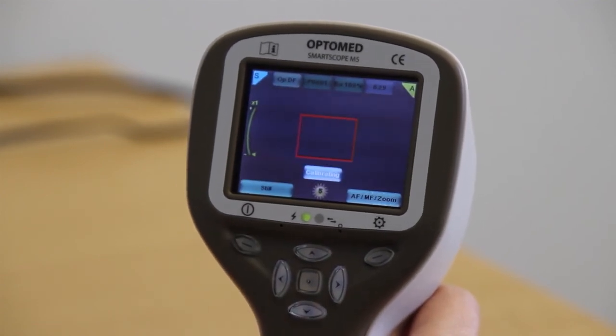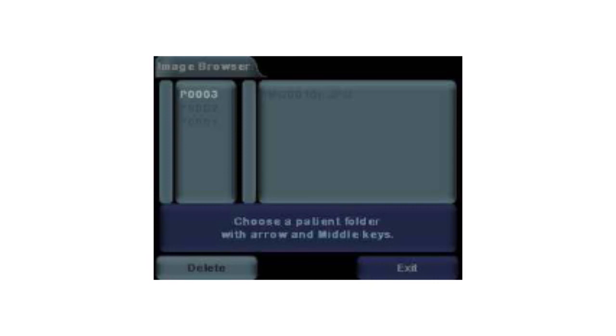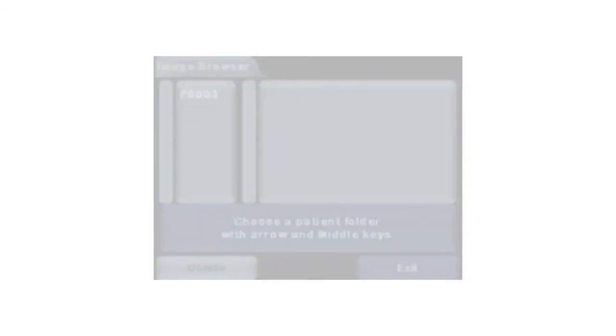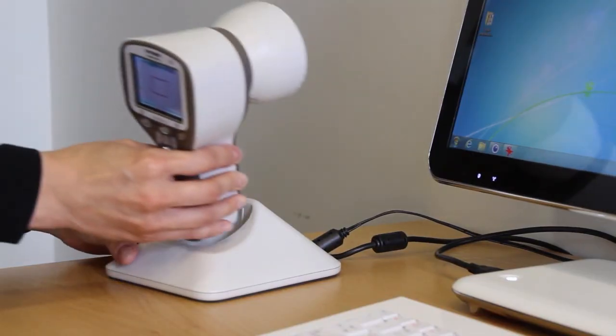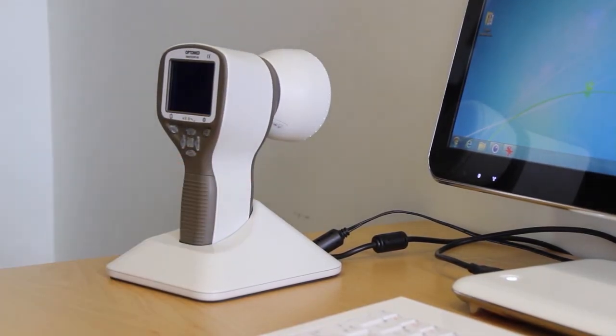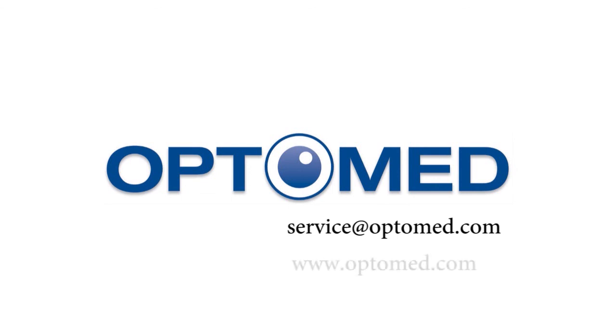If you want to preview images, go to the device menu and select preview images. The most recent images will be the top images in the file folder. Images are uploaded to a computer by placing the camera in the cradle. The image transfer works through USB connection in a similar way to any other digital camera. If you need support or have any questions or concerns regarding the usage of the device, please contact our customer service at service@optomed.com. Thank you.